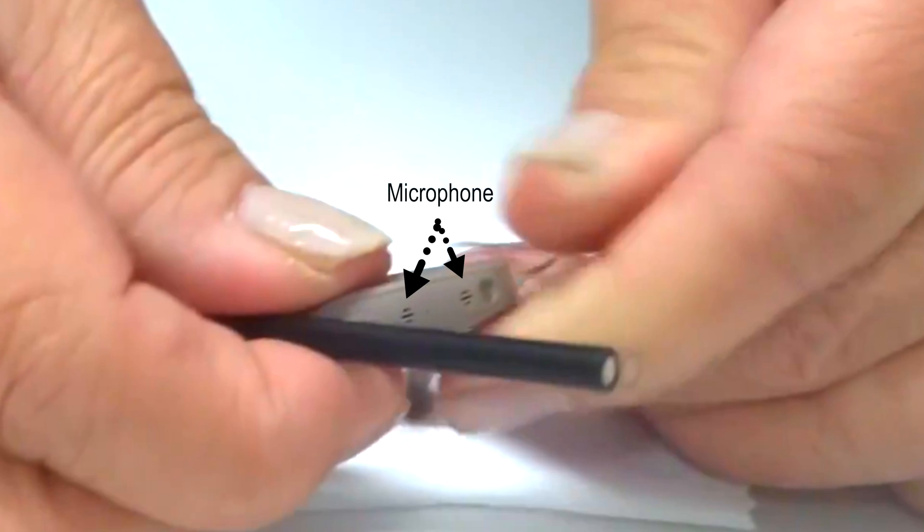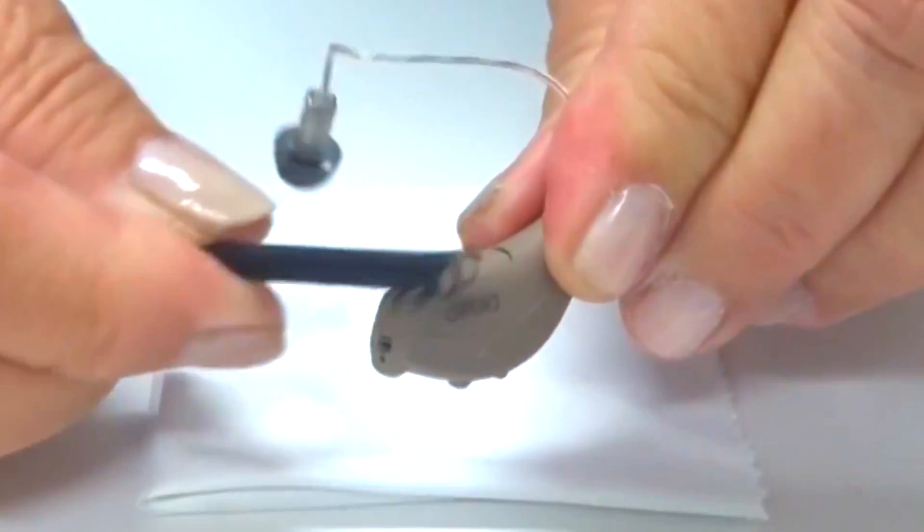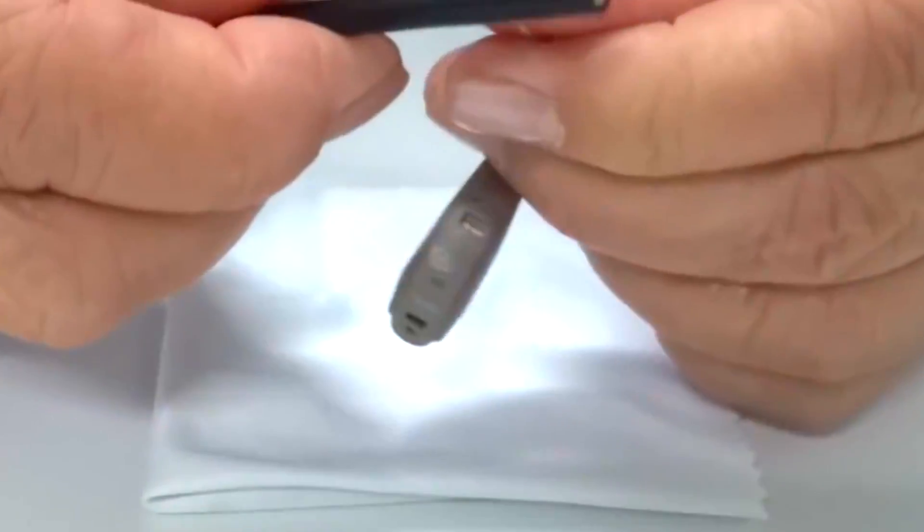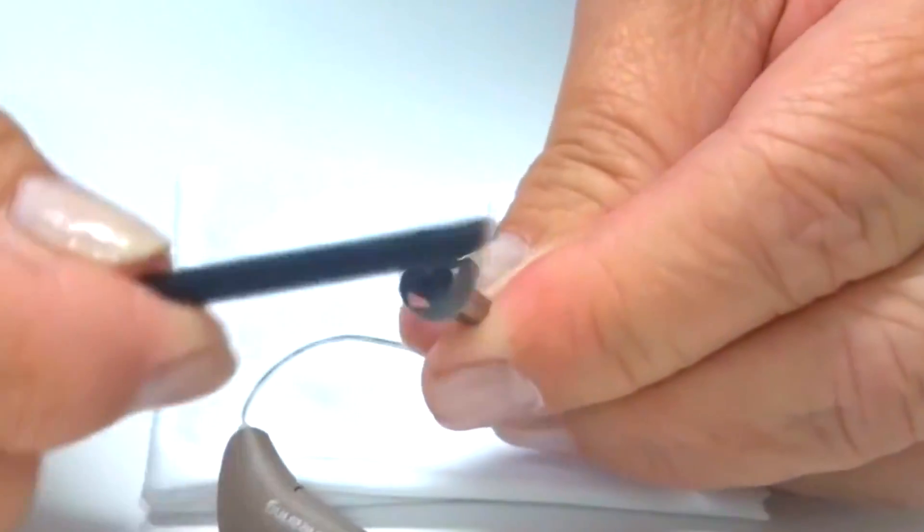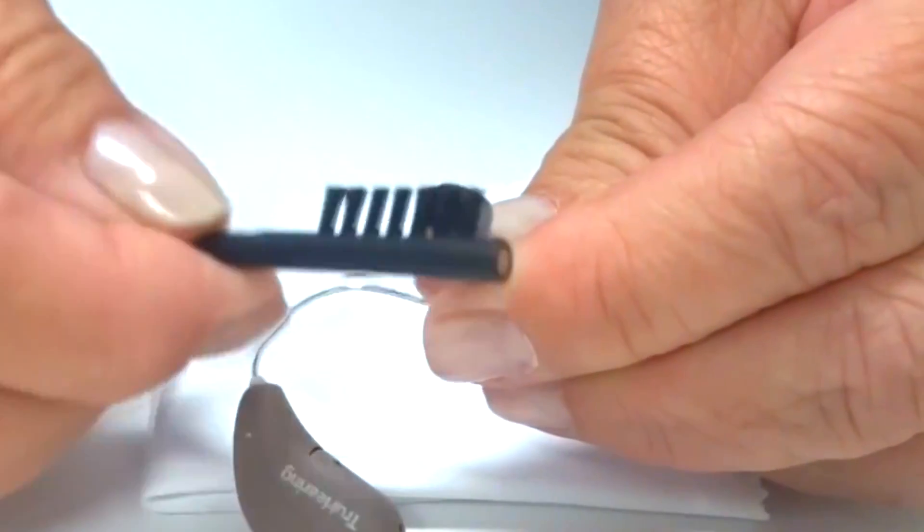Debris plugging the microphone will cause the hearing aid volume to be lower than normal. A brush can also be used to clean the hearing aid dome. If any earwax debris is still clogging the opening, remove the dome.